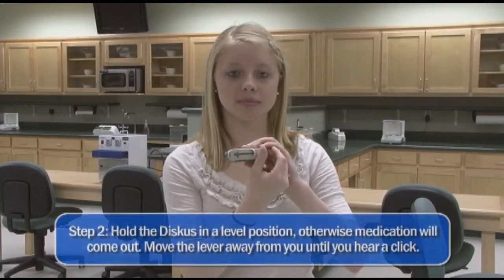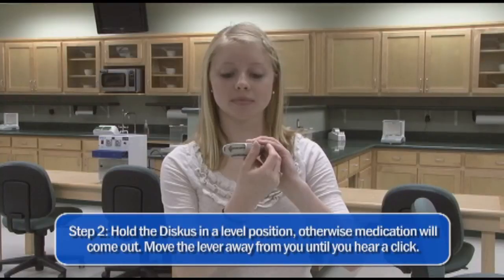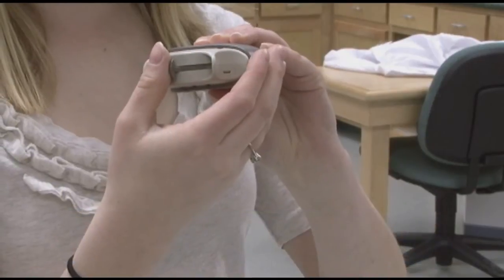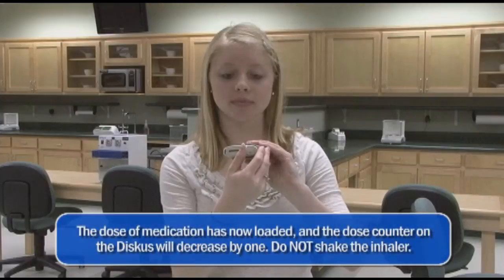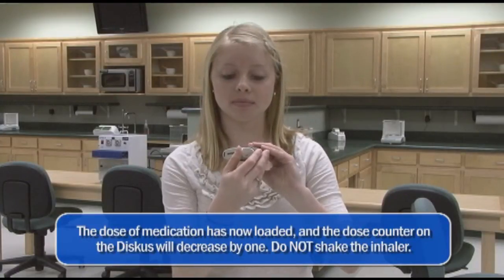It is very important to hold the discus in a level position, otherwise the medicine will come out. Move the lever away from you until you hear a click. The dose of medication has now loaded and the dose counter on the discus will decrease by 1.